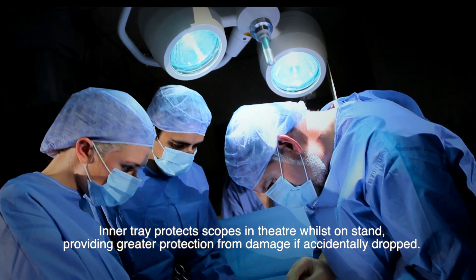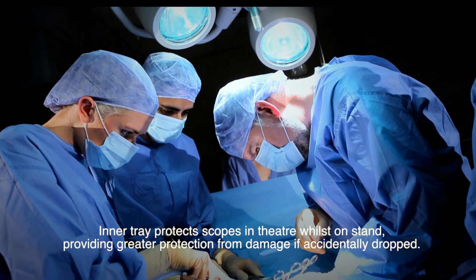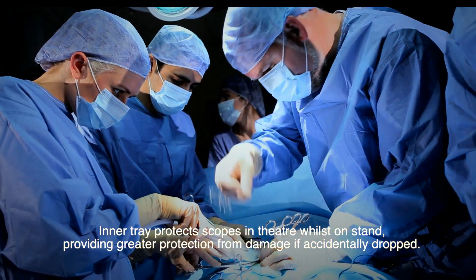Inner tray protects scopes in theatre whilst on stand, providing greater protection from damage if accidentally dropped.